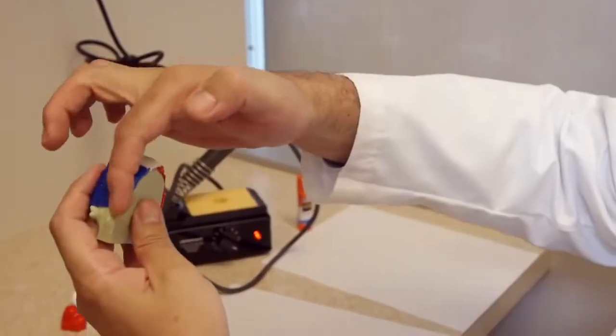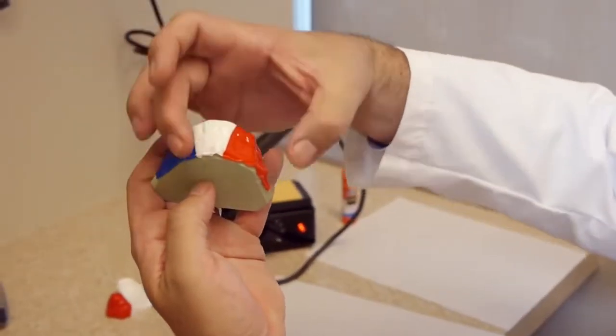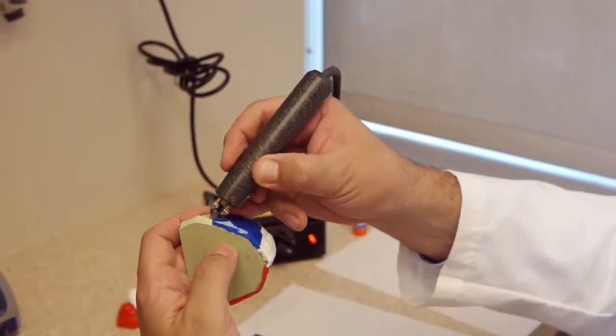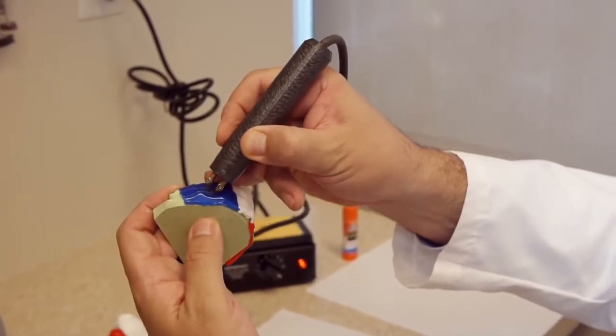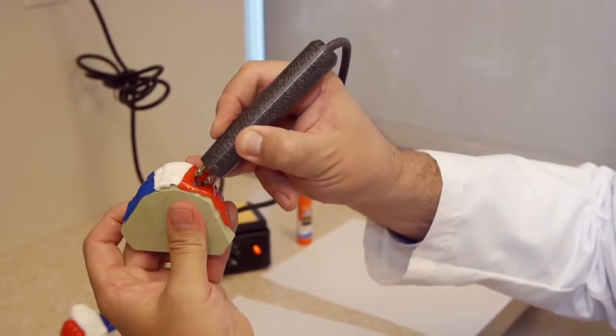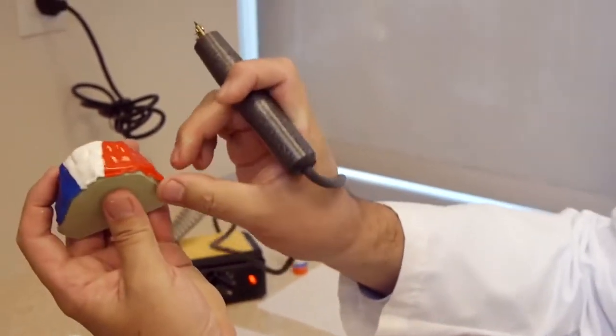Now we're going to keep it high here on the vestibular borders. The more you cover here, the better retention you have. So now we're going to cut to the highest level of vestibular border. And we're going to remove that excess.